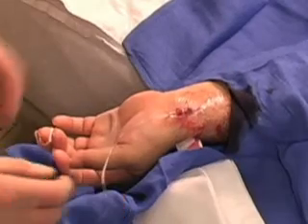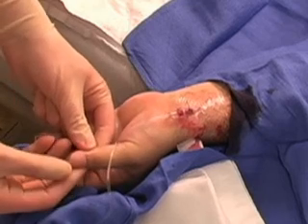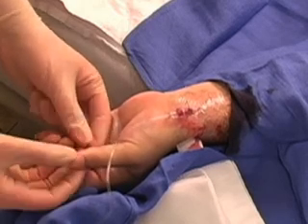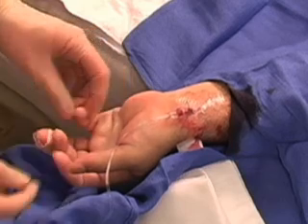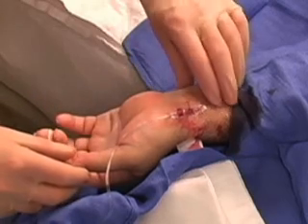Once the arterial line has been secured in place and the transducer connected, perfusion to the extremity should be rechecked. Perfusion should be checked periodically throughout the time the arterial line remains in place.